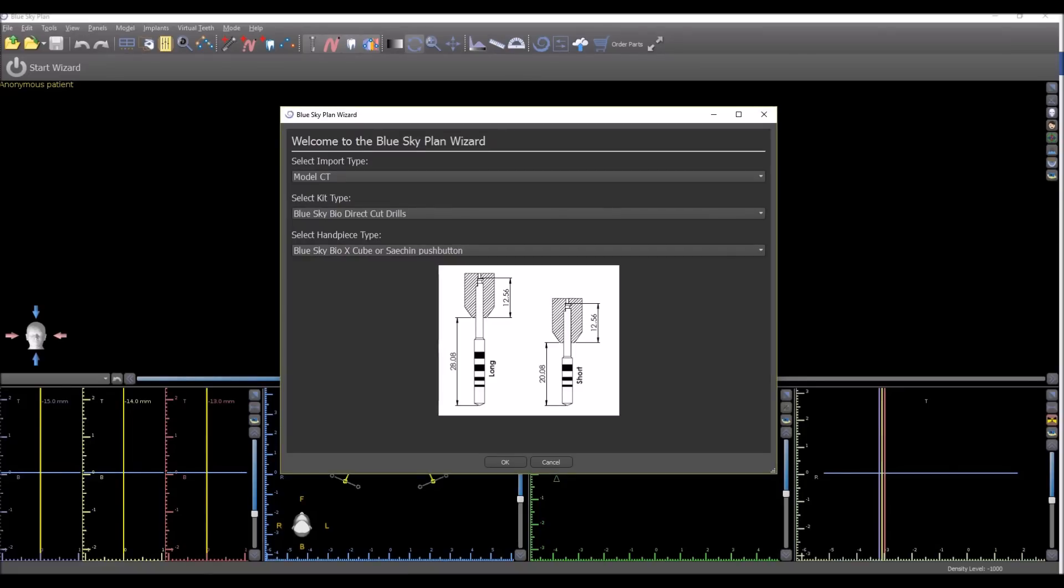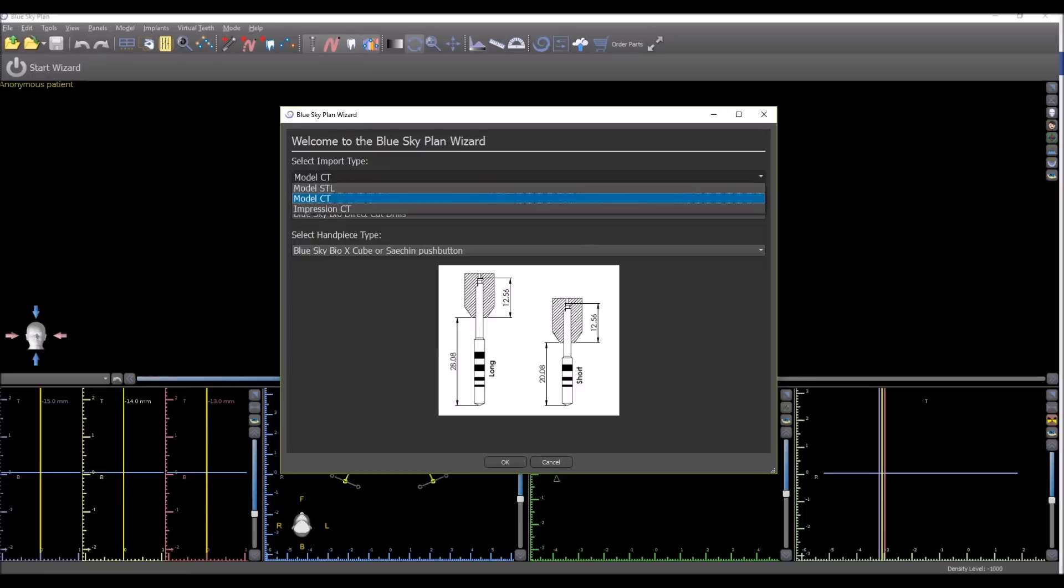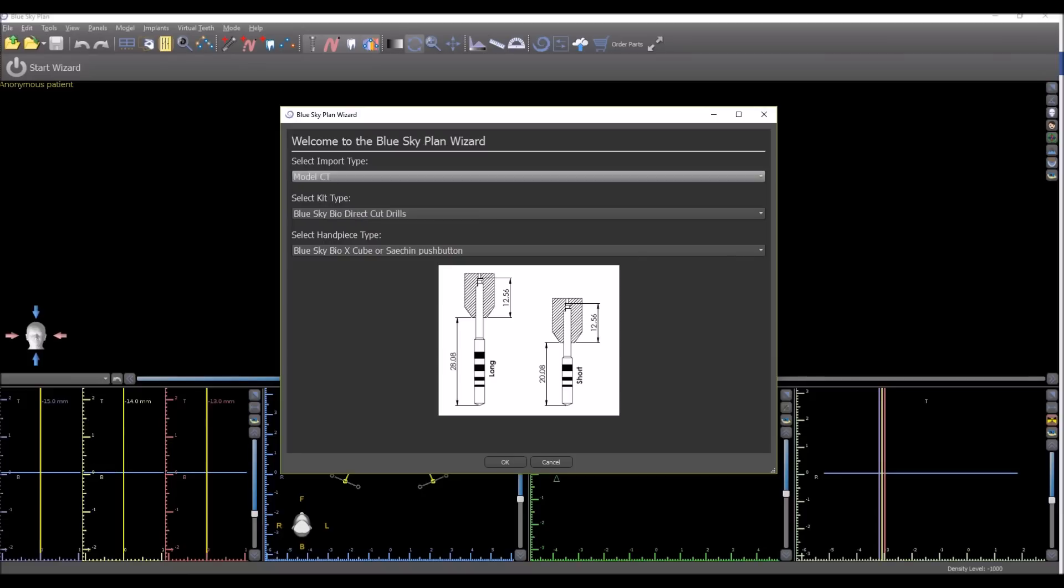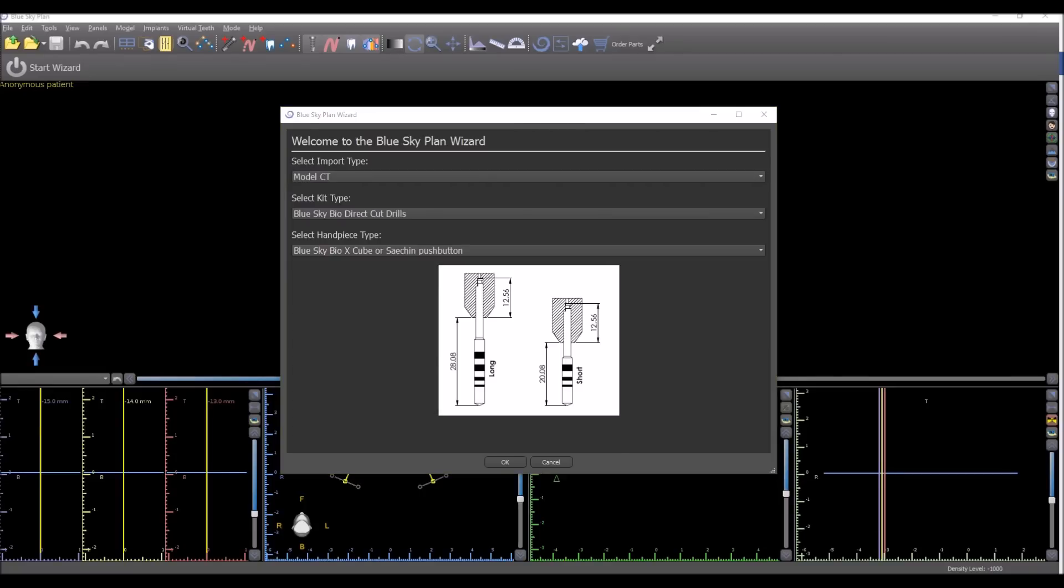As you can see, the welcome screen for the Wizard now allows the user to select which type of model or impression they're going to be importing. Whether it's a model STL, model CT, impression CT, and of course, depending on the selection of the user, the Wizard will take the user through a different process flow.